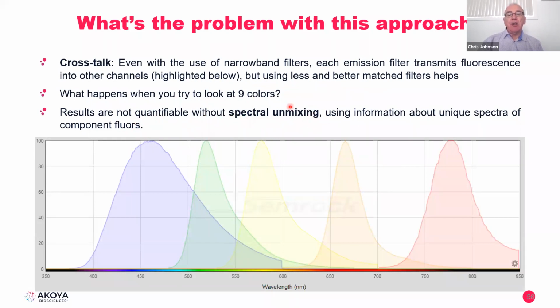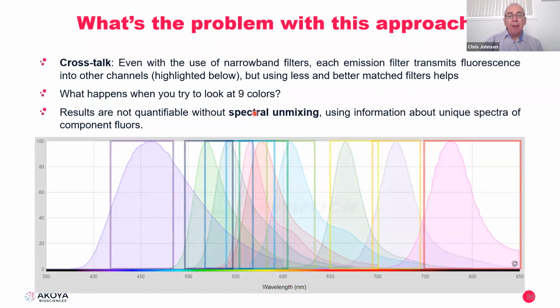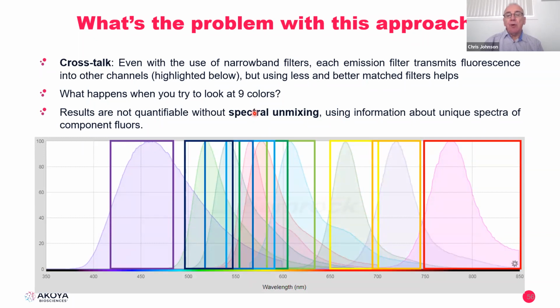And this is the function of instruments such as Mantra or Vectra or the PhenoImager as we have now, or Polaris as its old name was, because these have the capacity to do spectral unmixing. This means that when we have a large group of dyes together, the filters are unable to really separate those that are closely matched.